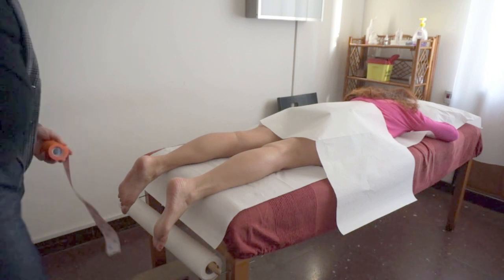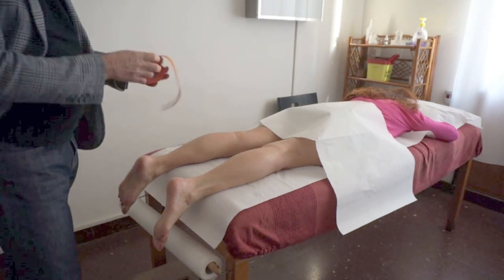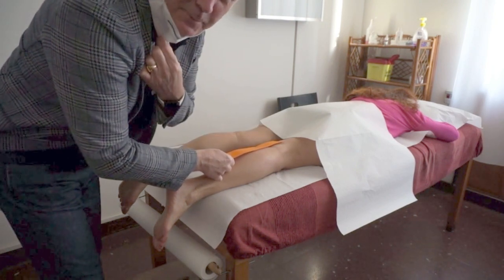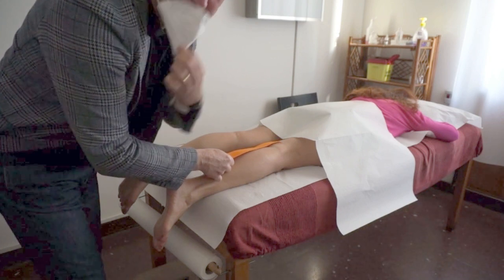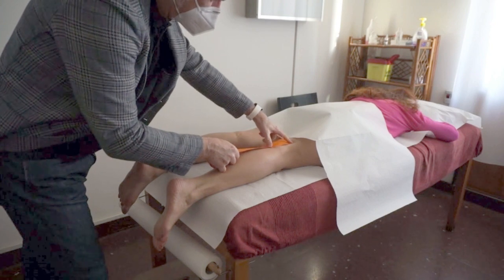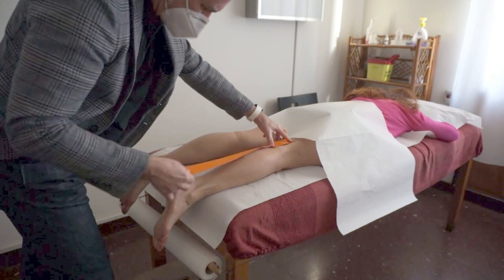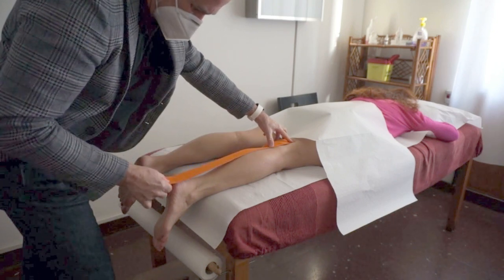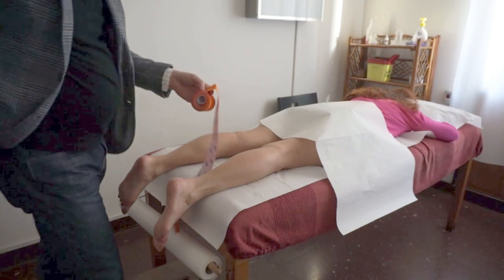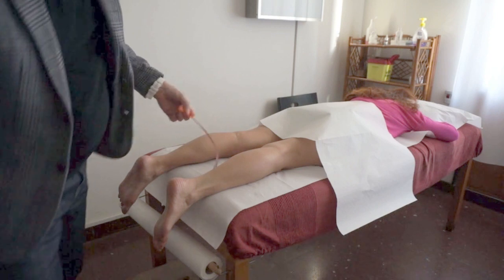In this video presentation I'll be going through step by step how to apply the tape correctly to the lower limb. We're in Italy in a semi-lockdown situation, so we have to use the mask when with patients. In this short video I'll be showing you step by step the correct application for applying neuromuscular taping and decompression over the lower extremity.